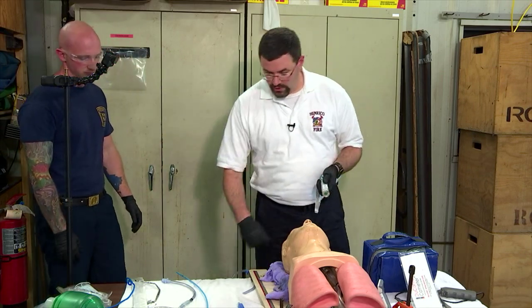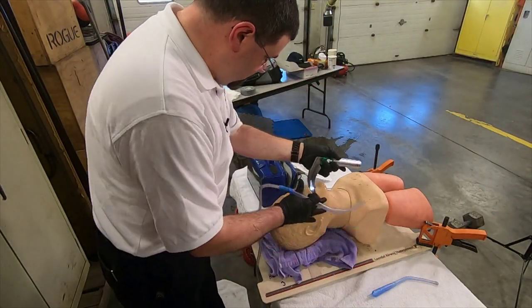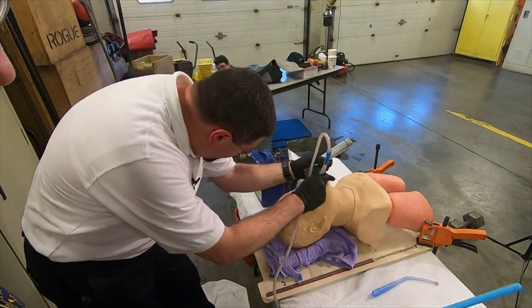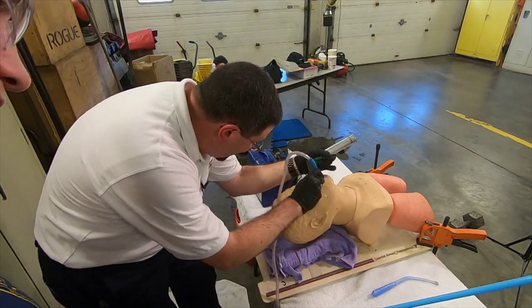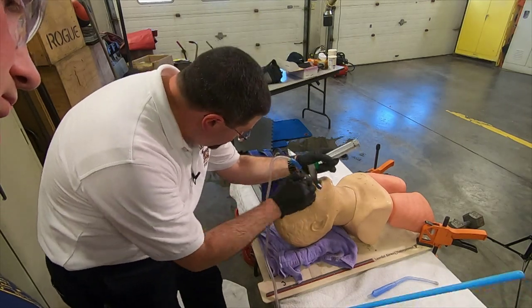There we go. So I now have a vomiting patient. Peter, if you'll suck. I'm going to go in, visualize as I go in, looking for the epiglottis. I'm going to insert my catheter, clear the airway. Good. Then I'm going to park the suction catheter behind the vocal cords and park it to the side so that the tube stays.